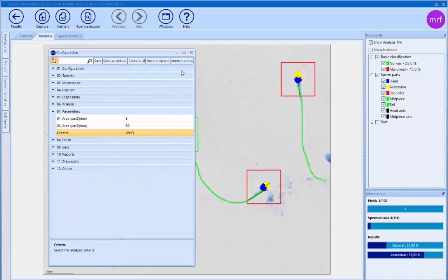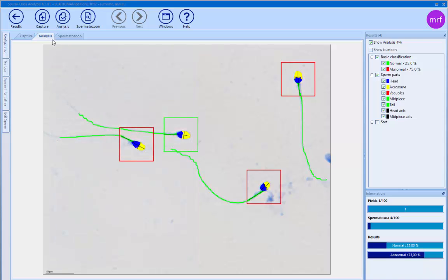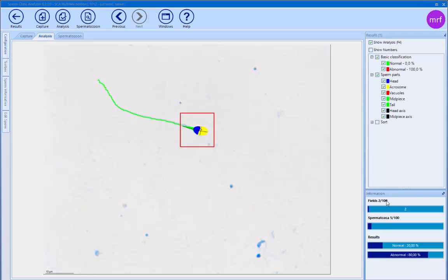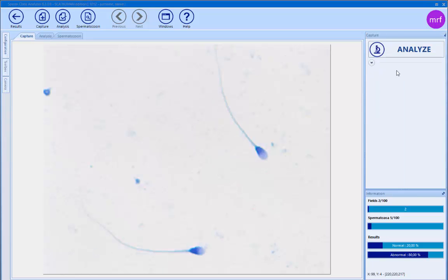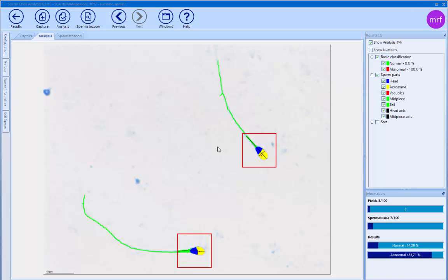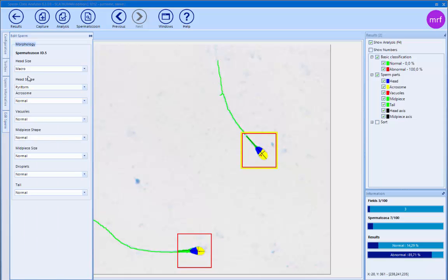The idea is to analyze different sperm fields to reach 100 sperms. It's also possible to use a motorized stage to do this automatically — the system will autofocus and analyze the different parts of the sperm: the head, the acrosome, whether there are vacuoles or not, and the tail. For each sperm, we can see all the characteristics and why it's normal or abnormal.